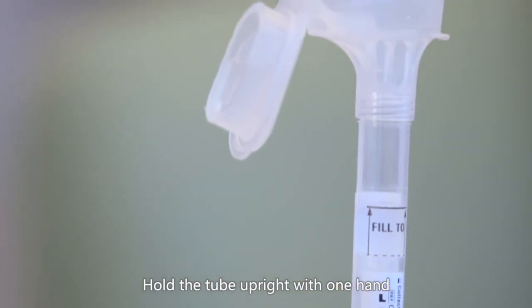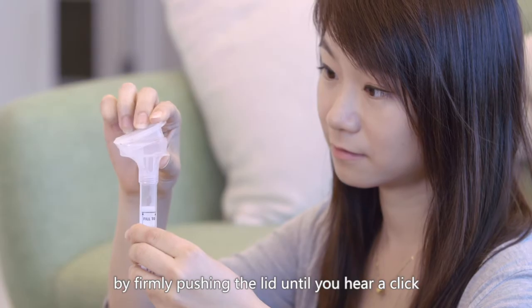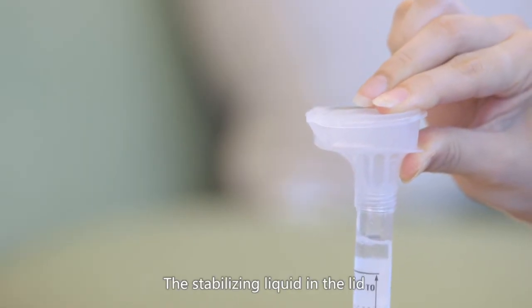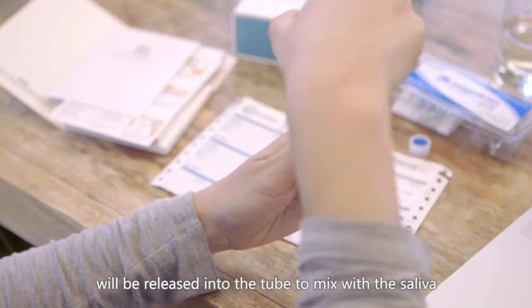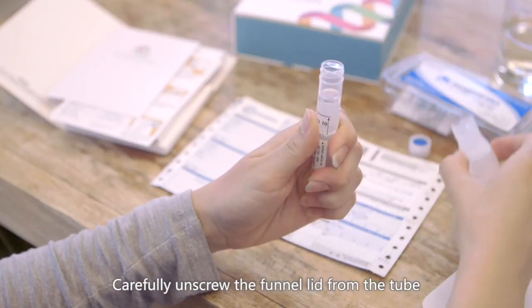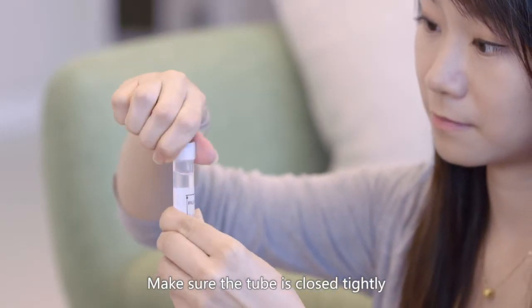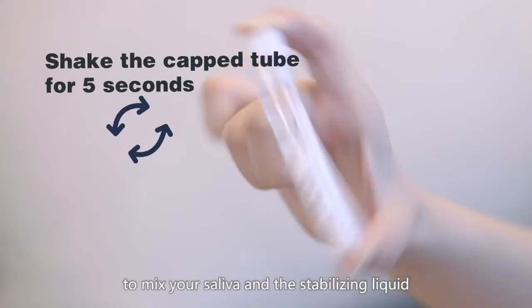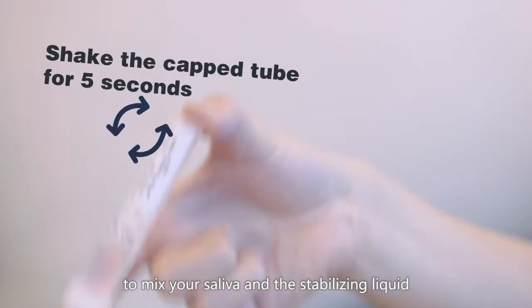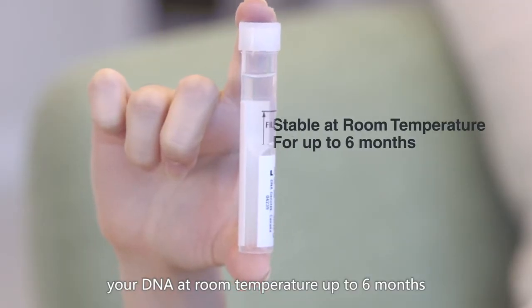Hold the tube upright with one hand and fold the funnel lid with the other hand by firmly pushing the lid until you hear a click. The stabilizing liquid in the lid will be released into the tube to mix with the saliva. Carefully unscrew the funnel lid from the tube and replace it with the small cap. Make sure the tube is closed tightly. Gently shake the capped tube for 5 seconds to mix your saliva and the stabilizing liquid. The liquid will stabilize your DNA at room temperature for up to 6 months.